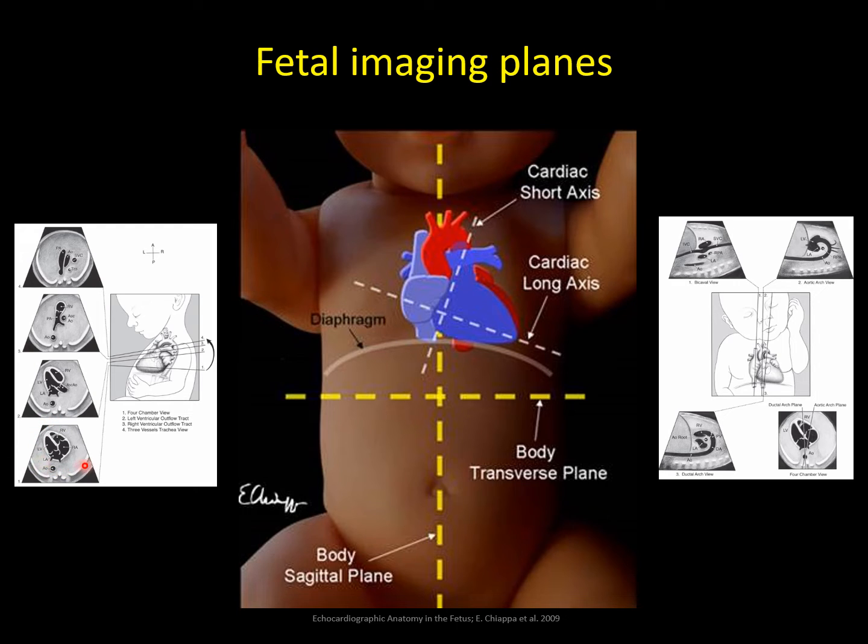Specifically, the rib shadows are not one rib on either side. There are multiple ribs shown. Slight rotations may need to be made to get that to look proper. But you can see that from the four-chamber view up to the outflow tracts, and then the three-vessel and three-vessel tracheal view, they're just slight sweeps more cephalad in the fetus in that transverse view through the fetal chest.